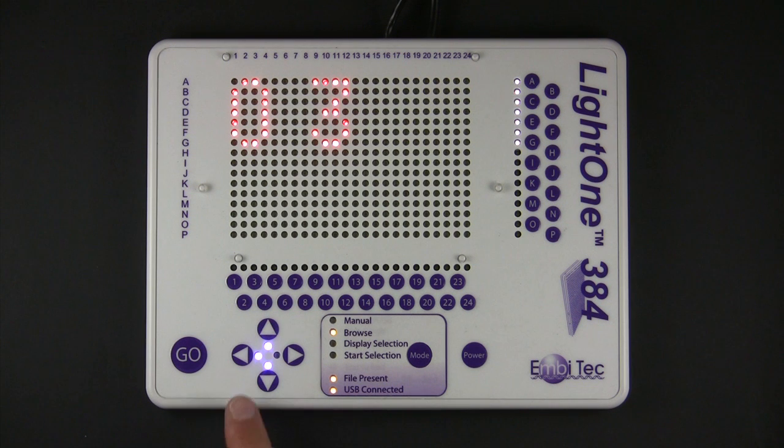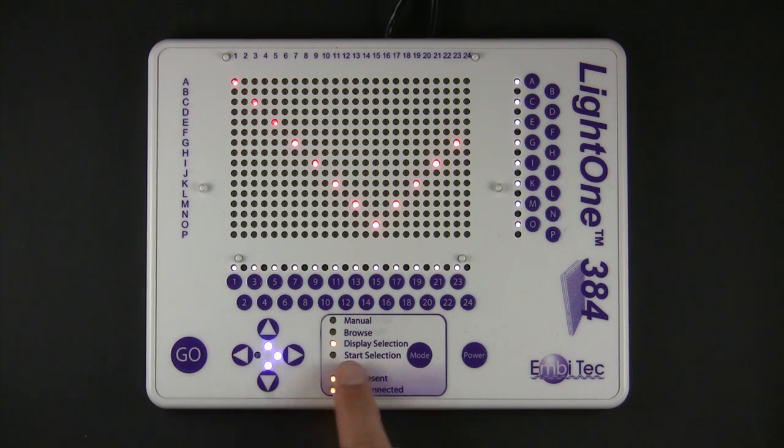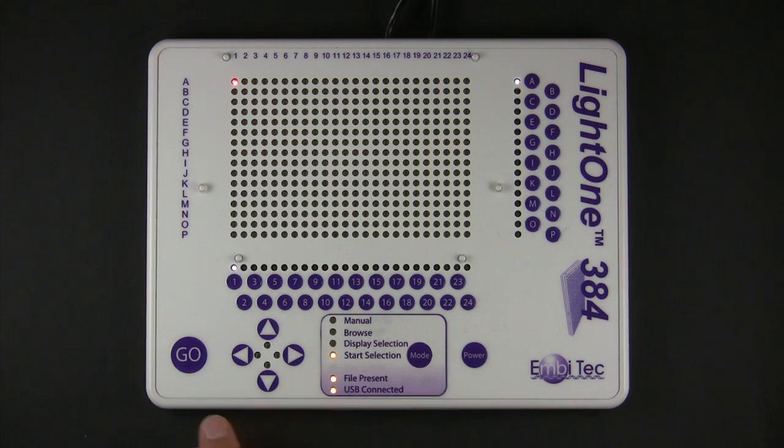Once you have selected your template, press the Mode button to switch to start selection mode. Use the Go button to step through the template.